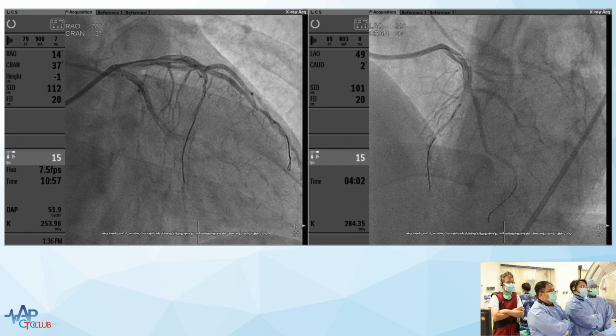Yeah. The other question is, if you start antegrade, how do you manage the two systems in the one catheter? So do you keep with the one catheter and just use two low-profile microcatheters? That can cause problems. Or do you put a second guide and do ping-pong? Because, at least in my experience with ipsilateral collaterals, when you try and do everything with one guide, it generally becomes very difficult. Yeah, I see. Difficult. So I think especially get the advanced microcatheter.